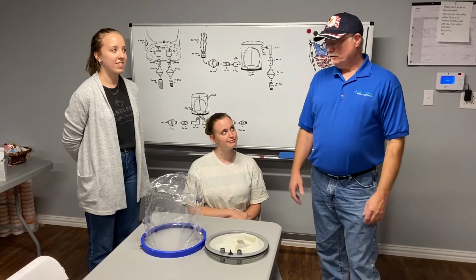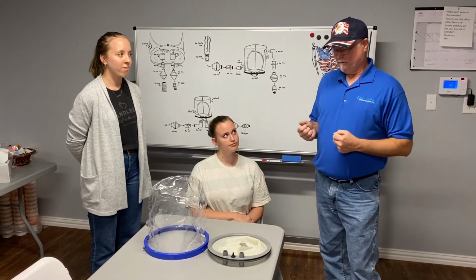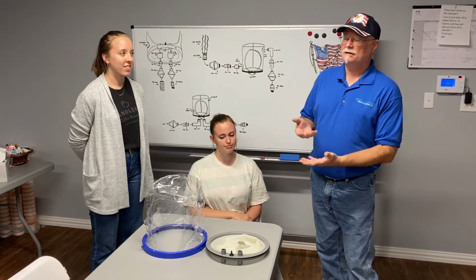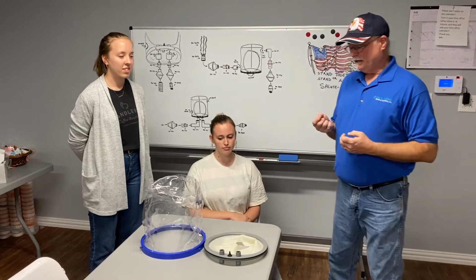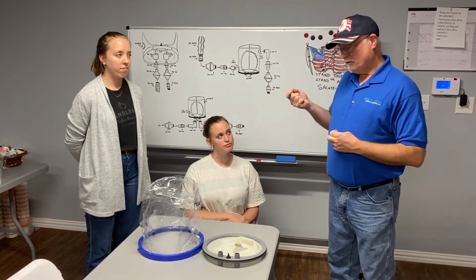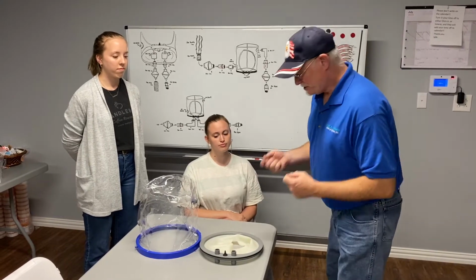Now I'm going to show you a second way to assemble the hood and neck seal and put it on the patient. There are lots of centers who really like to assemble them in advance and then put them on. And there's a very critical feature as part of this, that also applies to the method of putting them on separately, which is the proper orientation.